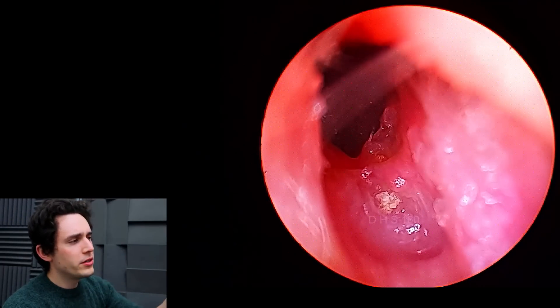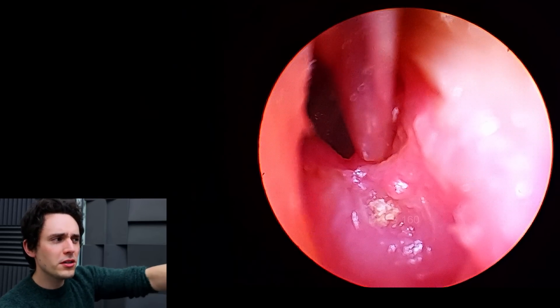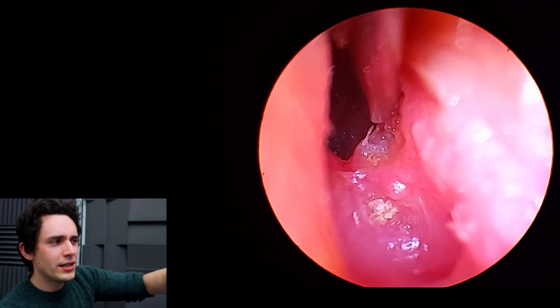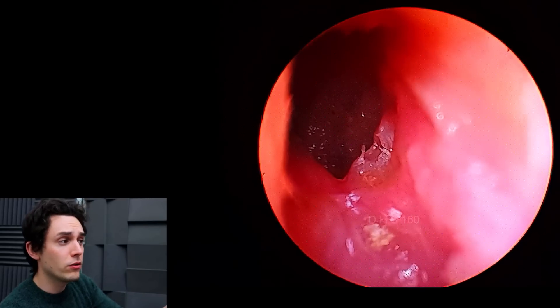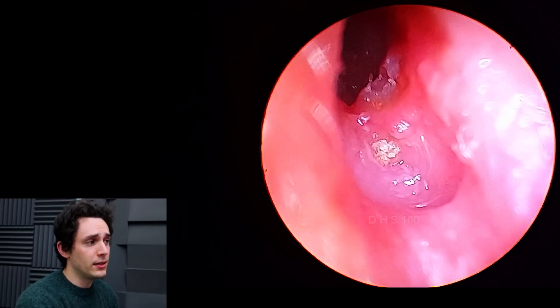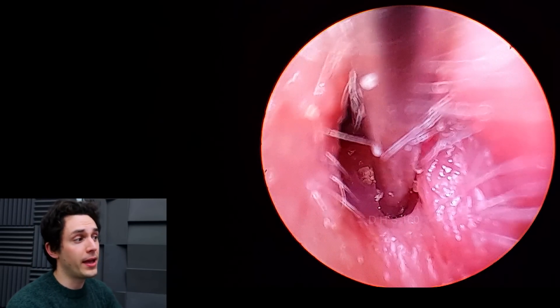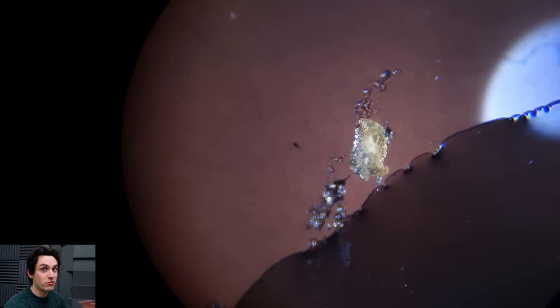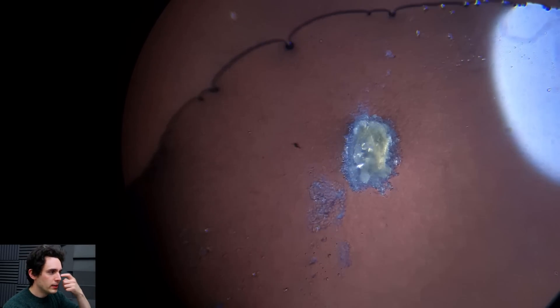So what we're going to do here is clear away as best we can. I'm going to spend a little bit more time up in that part of the erosion — you can just about see that little bit of bone; it looks kind of golden. What I'm doing is making sure there's nothing else to come away and there's not a second pocket of keratin hiding there. Once we've cleaned it out as best we can and gone as far as we can, we take video and several images and often send that to our ENT doctors. Depending on the severity, this patient is now in line for a meatoplasty, probably — I'll explain what that is in a moment.